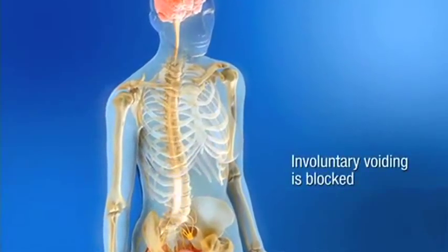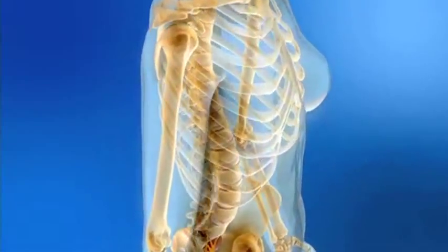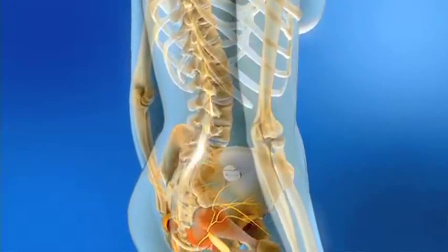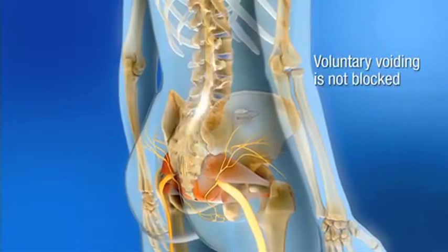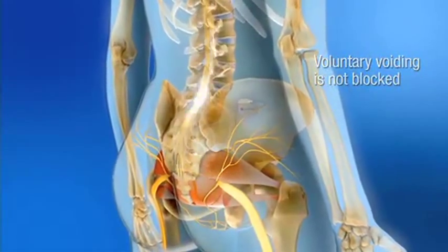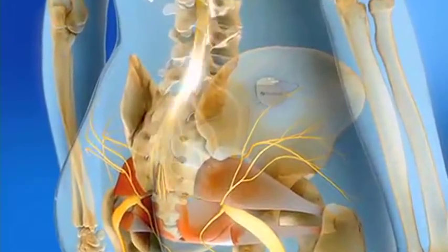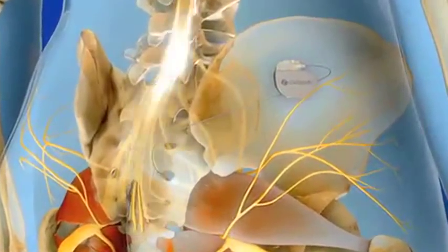This suggests that sacral neuromodulation patients experience normalized sensory signaling to the control centers of the brain, while motor pathways are uninhibited so as not to suppress voluntary voiding. Unlike other therapies that target the bladder, bladder regulation via sacral neuromodulation occurs without physically influencing the bladder or sphincter muscles.